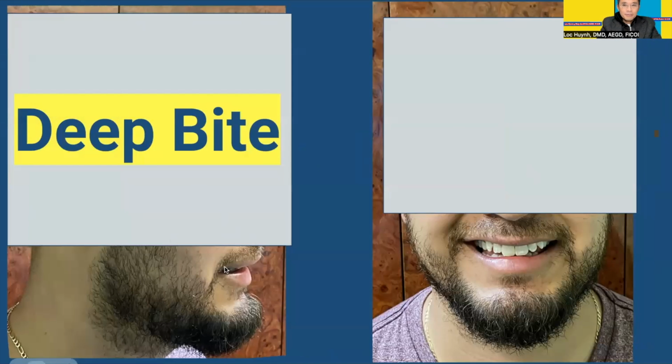I have a lot of pictures for the case, but I want to put together a very short video just to show you what you can do as a general dentist. This patient has quite a deep bite scenario. If I pull out the cover of his face, you will see a very concave curve, with a clear indentation of the lower lip. That is the indication that you have a deep bite, and you can see it in the profile.